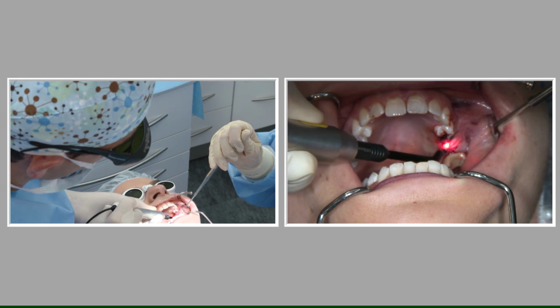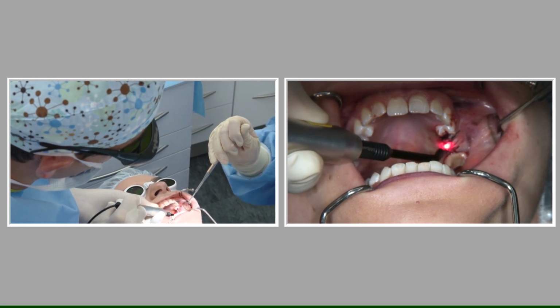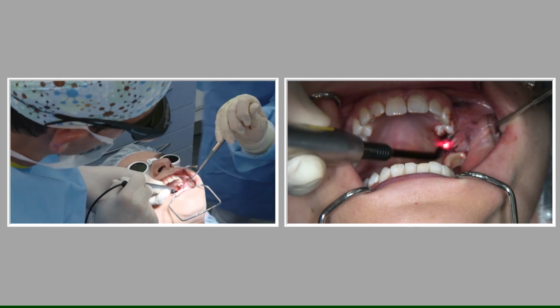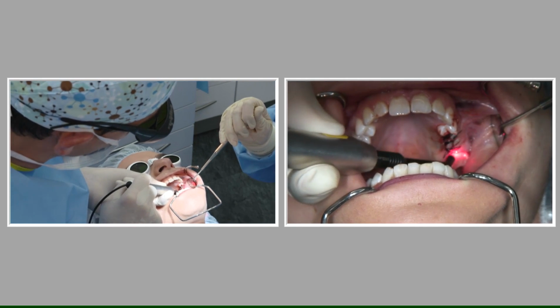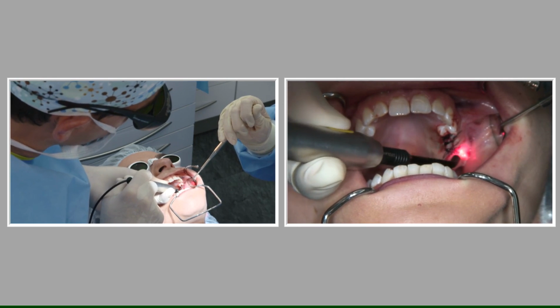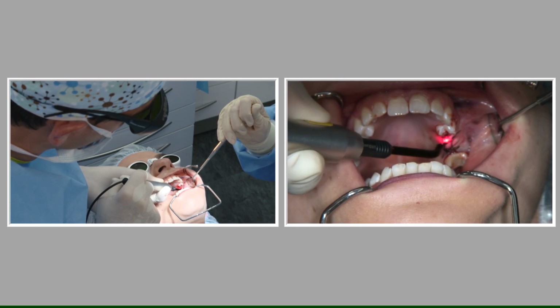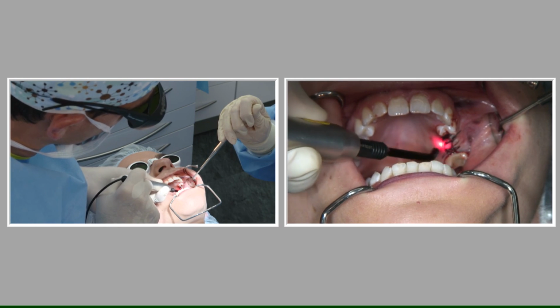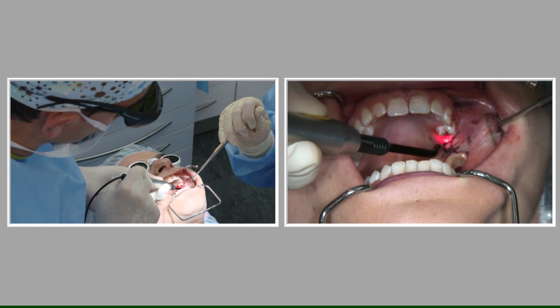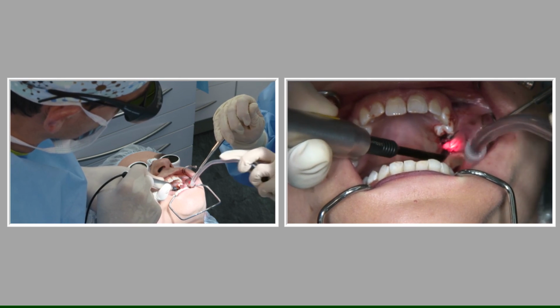So still using the soft laser for biostimulation. If you need any further information about the Zero Laser Blue, which we are using here, you can find this on the Sirona homepage.